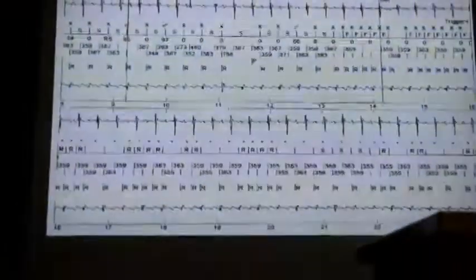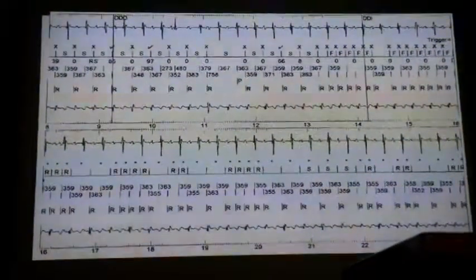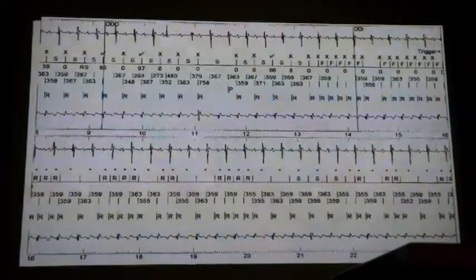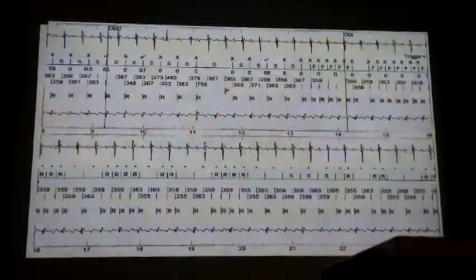This is a little Irish fella, right? He was very... the band. So anyway, we dampened his heart rate a little bit, just a little bit, and we haven't seen any problems since. Okay. He didn't like the inappropriate shocks, so he's quite good with taking his meds.